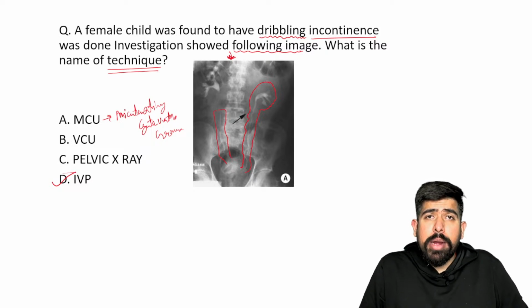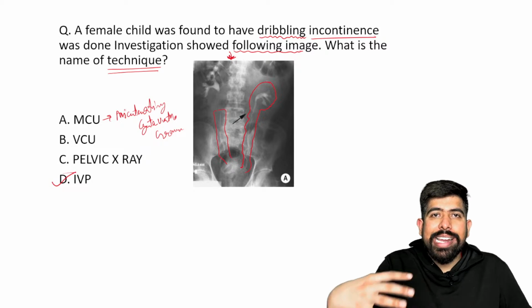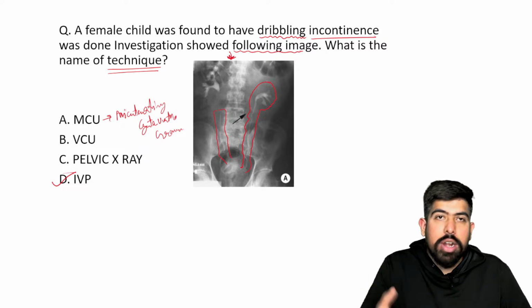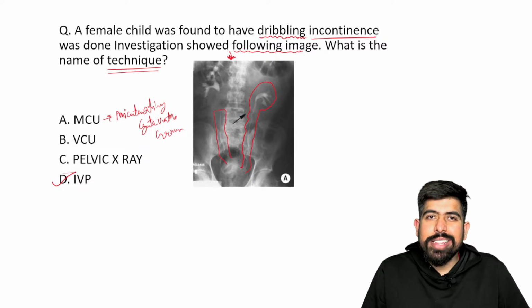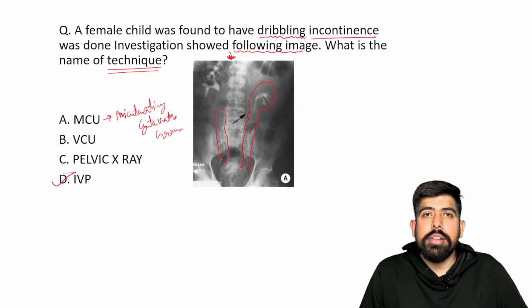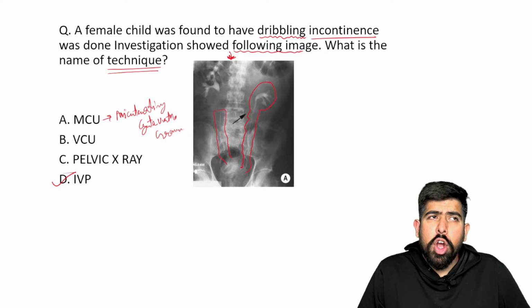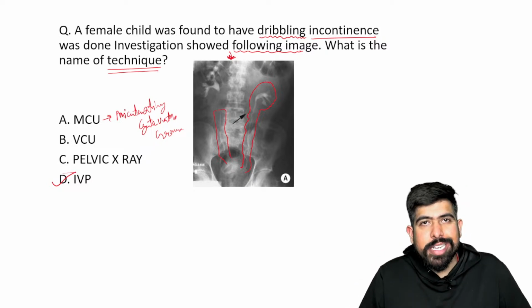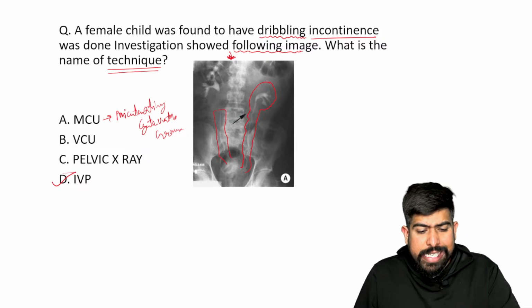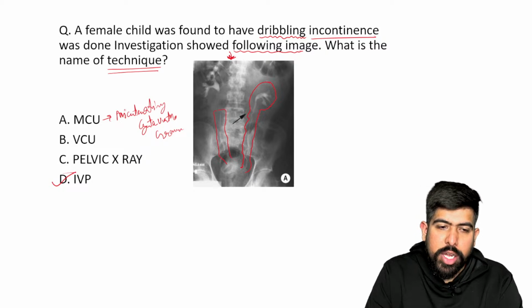And then, after filling your bladder, we remove the catheter, and we tell the patient to urinate this contrast which is filled in the bladder. Then the radiologist will do the X-ray. Frequent X-rays are taken, and there we see the anatomy of your bladder. If something changes the shape of the bladder, or some dye remains deposited inside the bladder, we can see it. So for seeing the bladder pathologies, guys, we are doing your MCU.